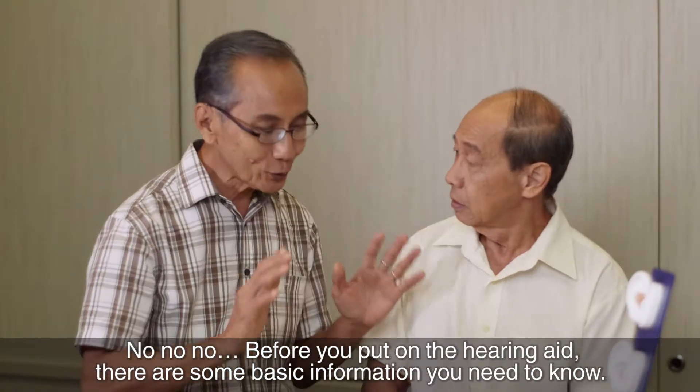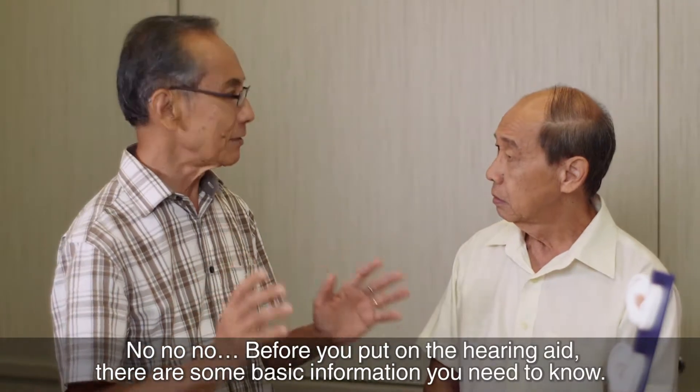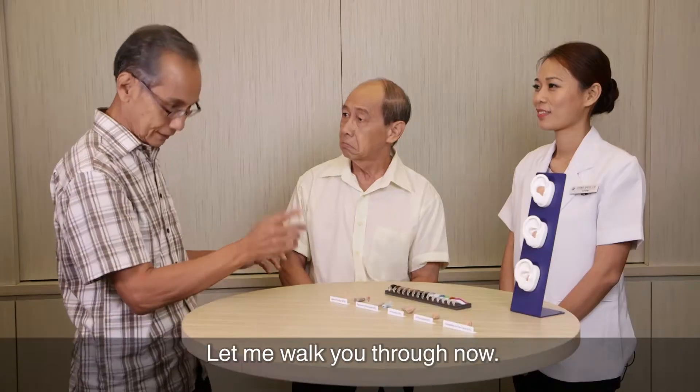No, no, no. Before you put on your hearing aid, there are some basic information you need to know. Let me walk you through now.